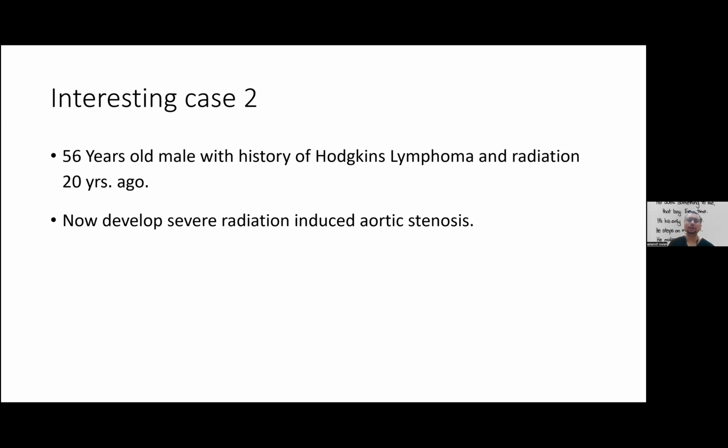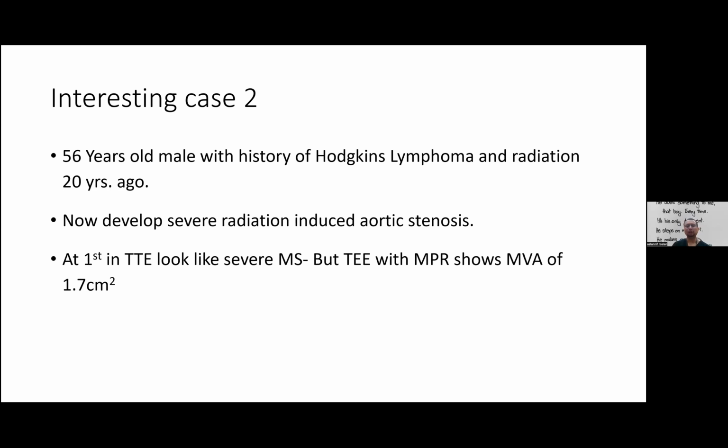One of the commonest cardiovascular complications of cancer treatment is radiation-induced valvular heart disease. That usually happens many years after the radiation, and that's why sometimes it's very important to get a history of radiation. And this is very pertinent, especially when we talk about someone with breast cancer, blood malignancy like lymphoma, and also certain types of lung cancer where they have radiotherapy to their chest wall. So I just wanted to show you after this the common pattern of radiation-induced valvular heart disease.